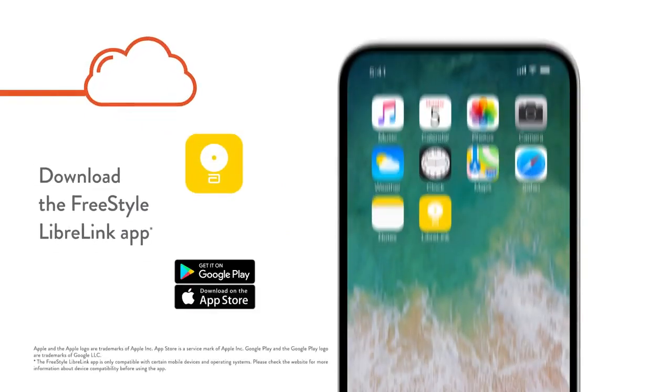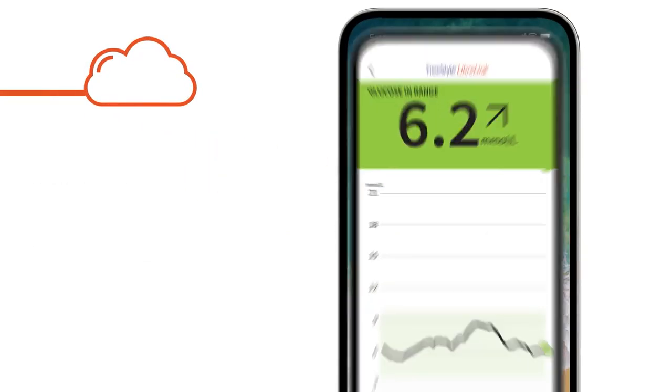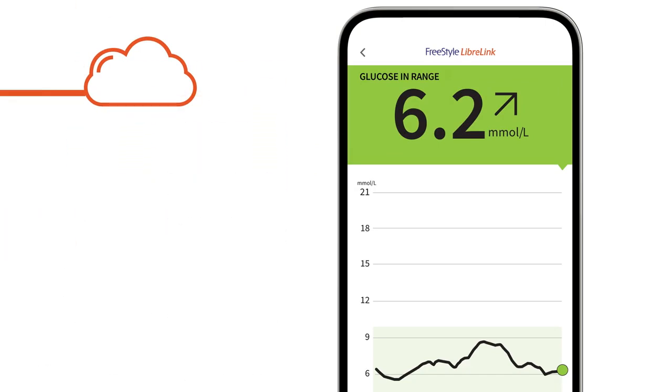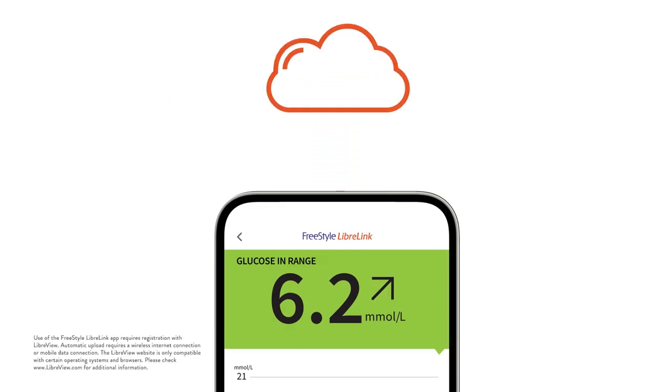When you download the FreeStyle Libre Link app, you can conveniently check your glucose using your phone — measuring, capturing, and storing glucose data, which is automatically uploaded to LibreView and shared with your healthcare team.